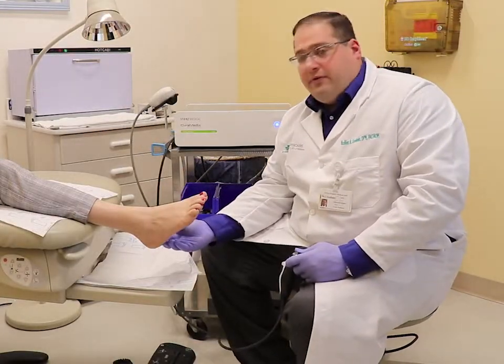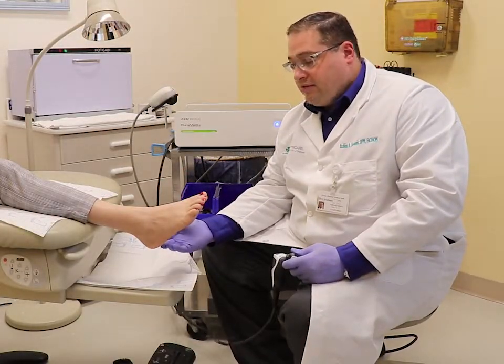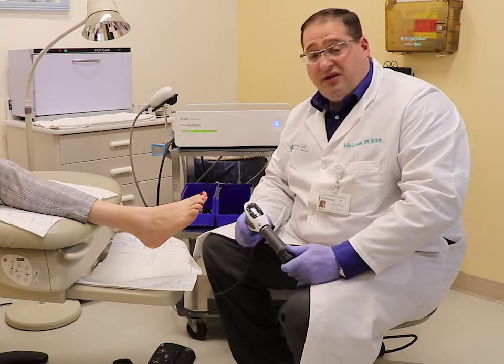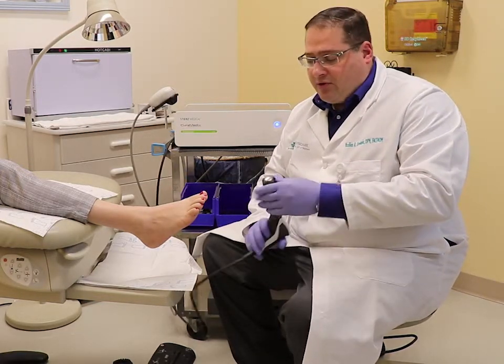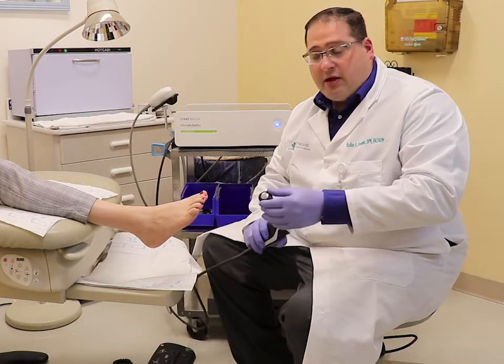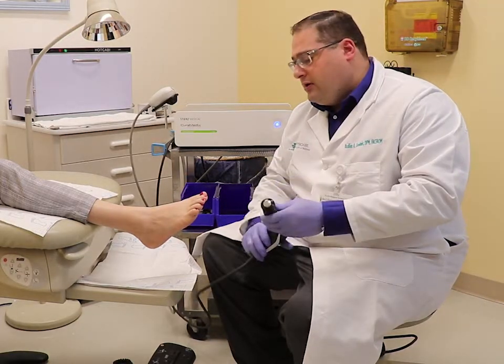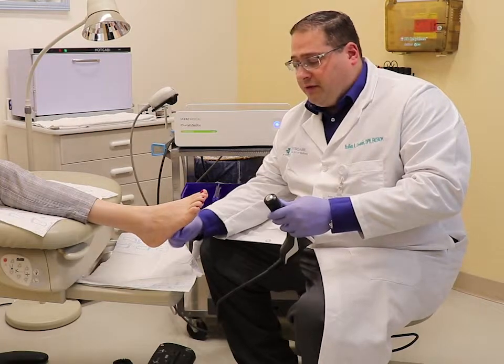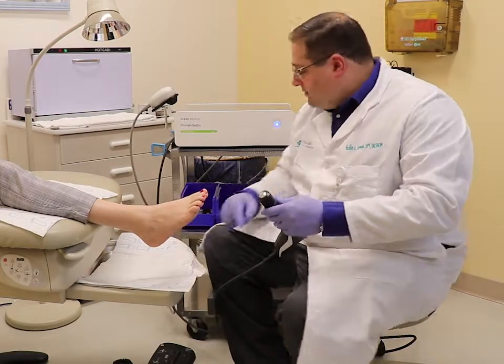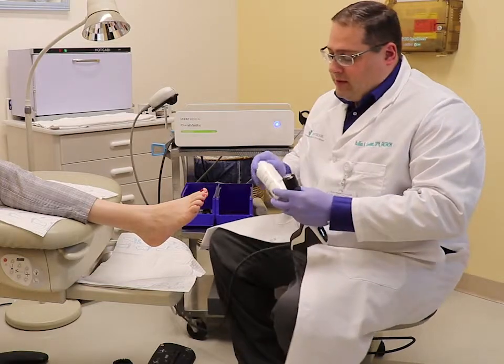The treatment to the bottom of the heel specifically is for 3000 pulses. This is preset on the device, so it stops at the end of the 3000. The next treatment is with a larger applicator. This is wider, so it tends to not go as deep. I use that for this part of the foot where there isn't as much padding. The treatment is the same.